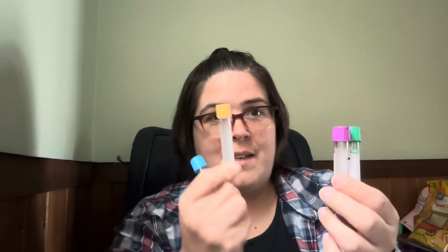So anyways, short little video, but I thought it would be interesting to share with you guys the most common tests that we run and the most common tubes that we use. Again, most common, kind of common, least common, but still gets run. So that would be it. And like I said, we do have red tubes, but we don't really use them because a lot of the tests that we get can either be run on a red tube or an SST gold, yellow, whatever you want to call this.